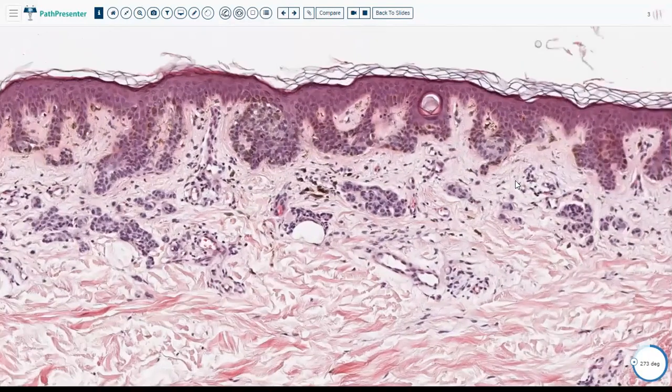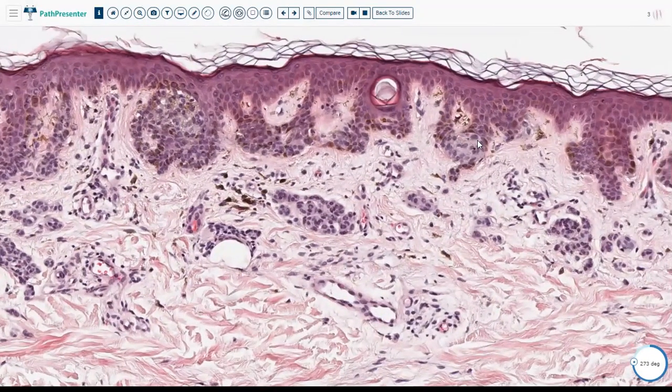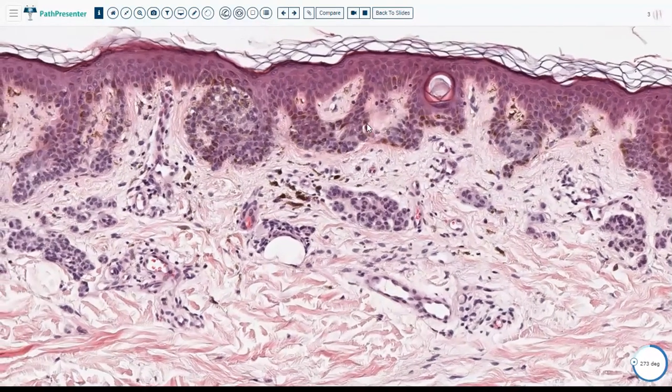Second of all, the cells. You can see the cells are a little bit large. They are a little bit clear and grayish compared to the ones we saw earlier, which is a feature of dysplastic nevi. Another important feature is the bridging. This one you would see mentioned a lot in your boards, and you'd see it a lot when they bring it for you in exams.